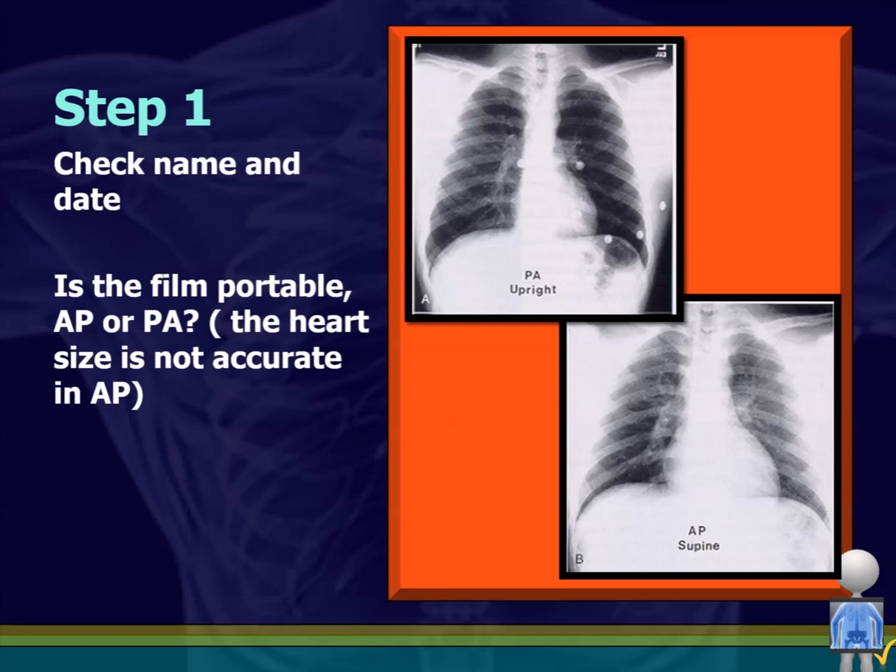Used to be a problem before EMR where someone could put the wrong patient stuff in the wrong chart, and if you didn't pay attention, you thought there was something wrong with them where there wasn't, or vice versa. Even with EMR, there can be things that are attached improperly to the wrong chart, and this can happen. Make sure it is the patient that you wish to be looking at.